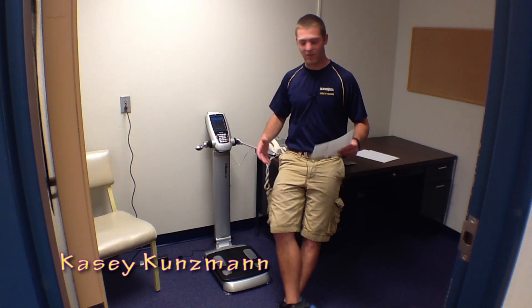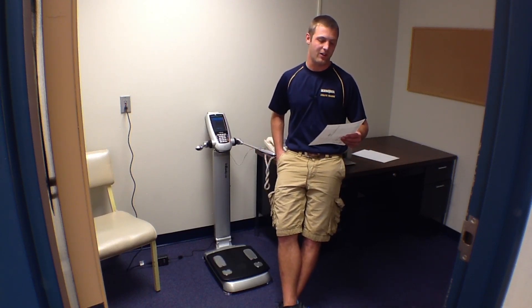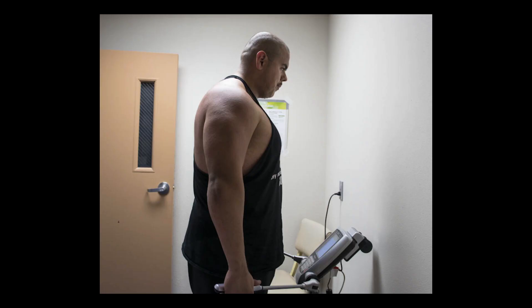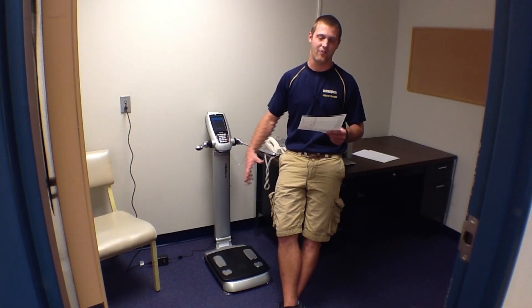This is a new InBody machine that we got. It measures body composition as well as lean body mass, and then it can analyze it for you in terms of how much skeletal muscle you have as compared to weight and body fat mass.